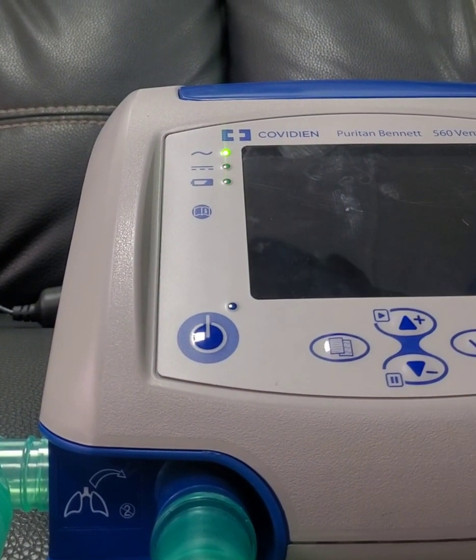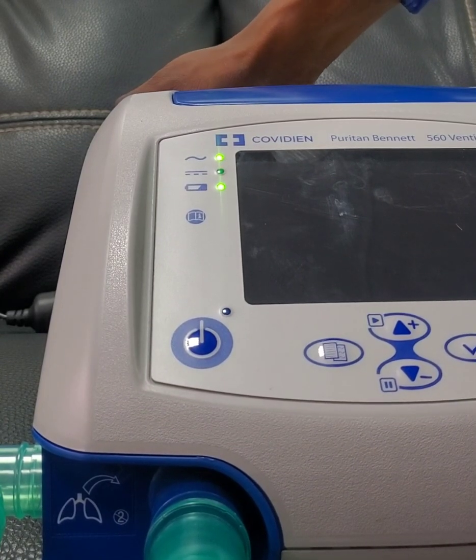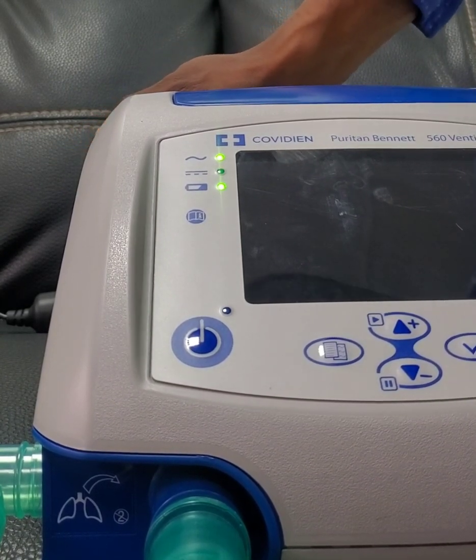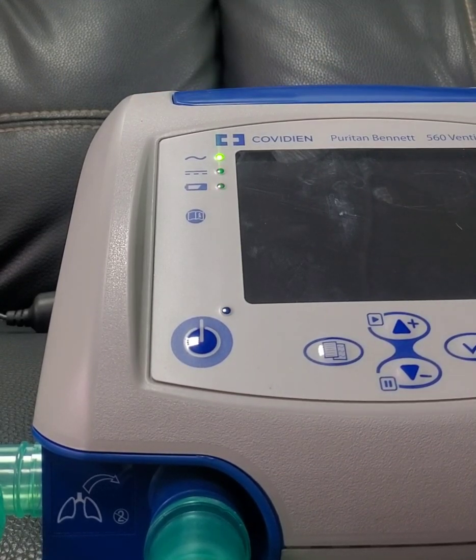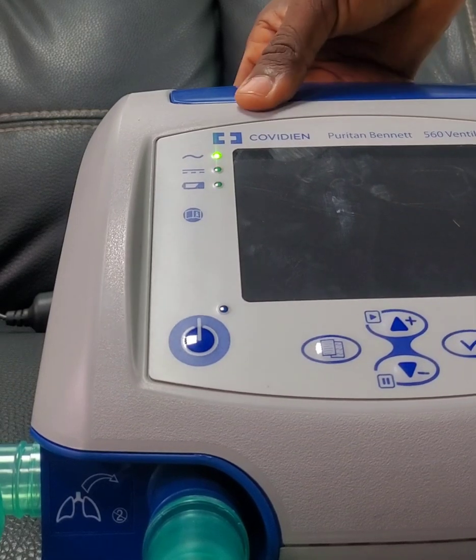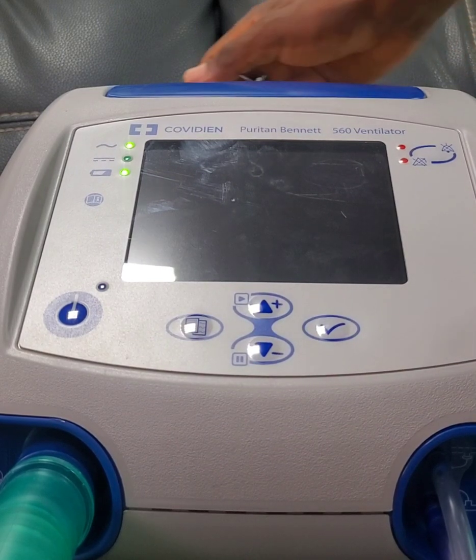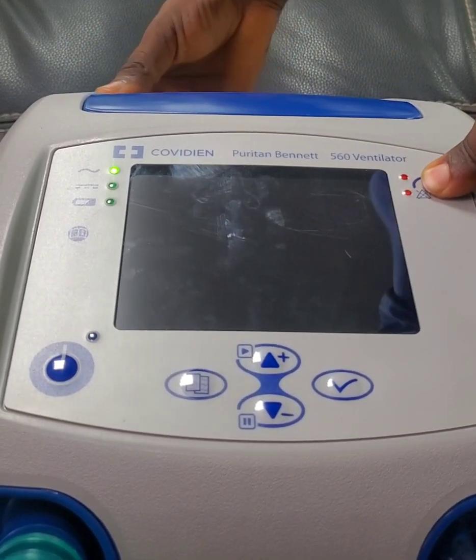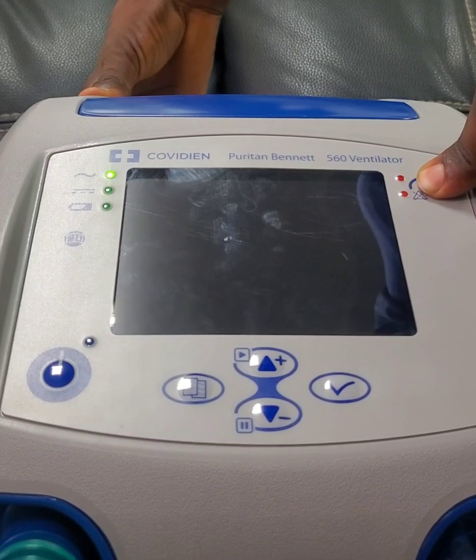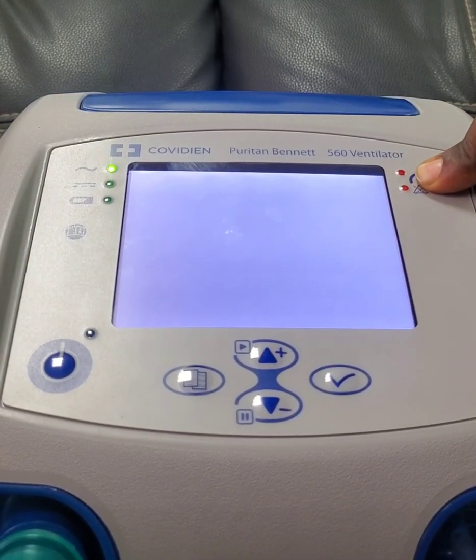Good afternoon, welcome to another PB560 ventilator video. Today we are going to be looking at the setup of this ventilator — the language, the time, the dates, and how to change from pediatric mode to adult mode. If you want to put this in setup mode, you hold on to this alarm button. Hold on to the alarm button when you power it on, then still hold the alarm button.